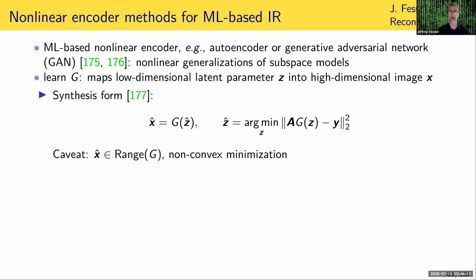All right, so remember again, in undersampled data, we need some form of dimensionality reduction, and most of the forms I've been describing are sort of linear in some sense. You have a dictionary, linear combination of atoms, or a transform, a matrix vector multiplication there. There's nonlinearity from the sparsity, but the key piece of it, the dictionary transform, is linear. This is inherently nonlinear now.